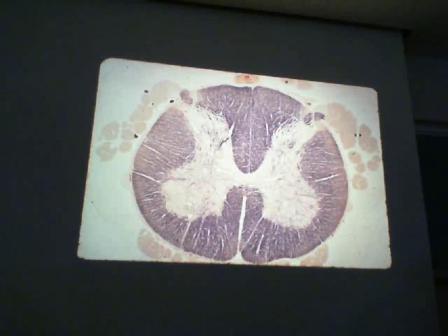And right down here we have what? Okay, that is the dorsal horn, and right in the middle we would find the central canal with the ependymal cells, but we don't see that in this particular slide. Now, if this were a course in neuroanatomy, you would be responsible for all the different clusters of cells and all the different tracts that you see around the outside here.